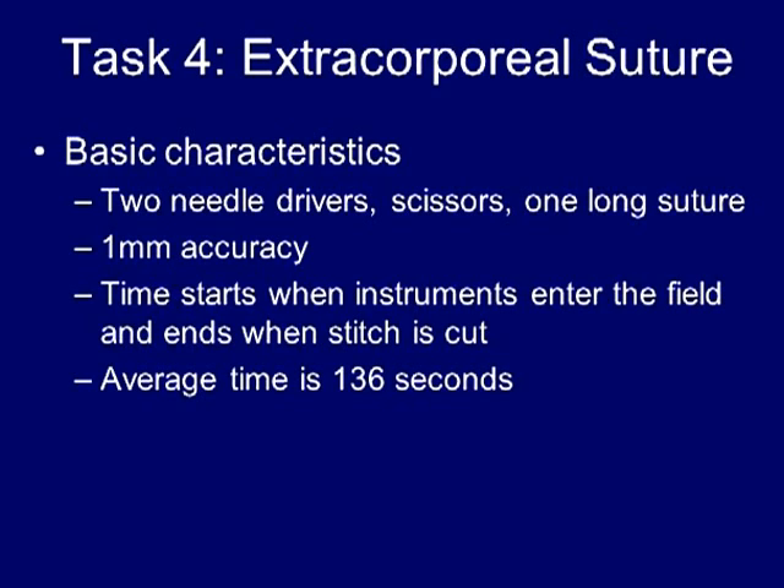The time starts as soon as instruments enter the field of view and ends when the stitch is cut. Average time to completion is 136 seconds.